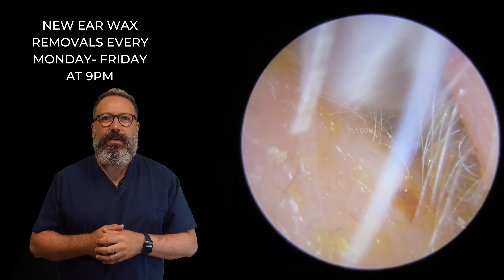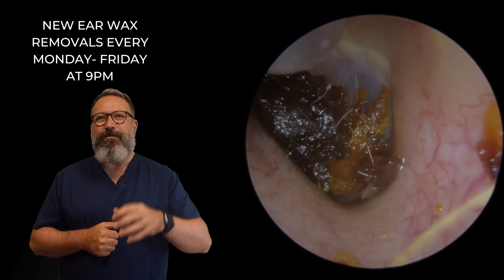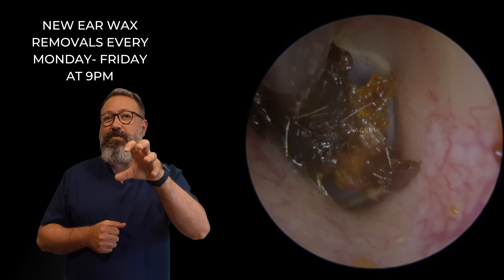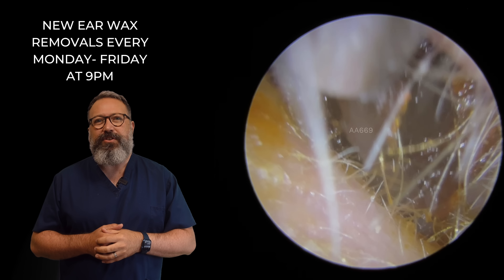There we go. And let's go back in now. You can see that very, very deep section. So this actually was one continuous plug, but it started to break down. As soon as we moved it, you could see it just started to break down. So we've got rid of that very last section there.